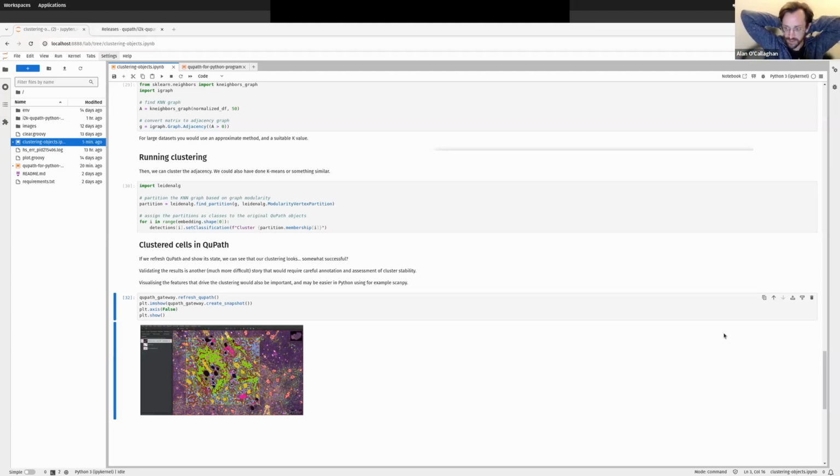Yes, being able to UMAP across images in a project and jump to the image and the cell, that would be indeed very useful. Currently, the viewer interaction is only jumping within an image. So that's a second level feature that might be more difficult in terms of jumping images. It would also probably test your patience as you have to wait for an image to load and the viewer to jump.